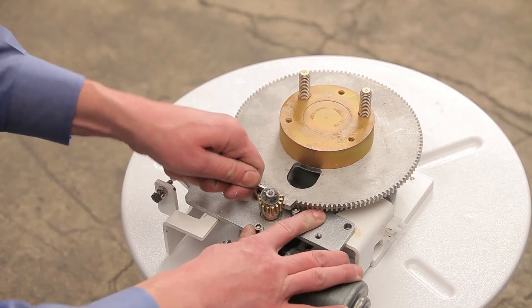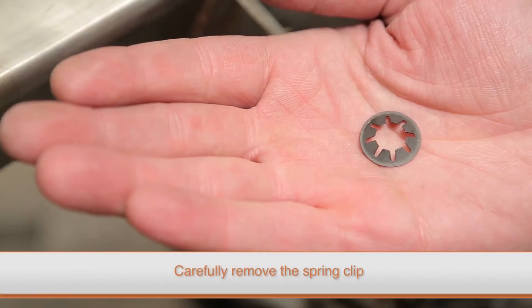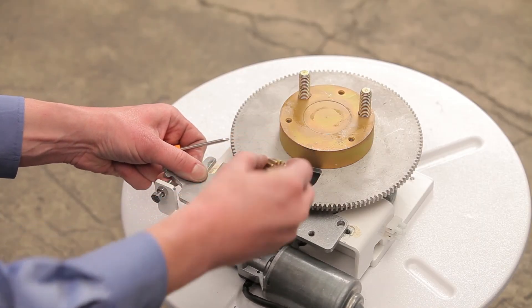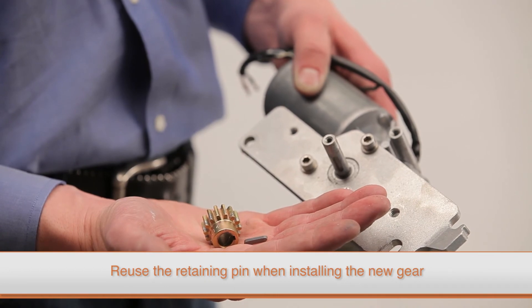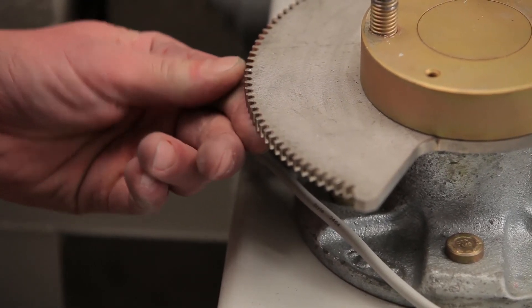To replace the small gear, remove the spring clip on the top of the gear using a small flat blade screwdriver to work the clip off the motor shaft. With the clip removed, pull up on the gear to remove it. Make sure to keep the retaining pin that locks the gear on the motor shaft, as it will need to be reused when replacing the gear.